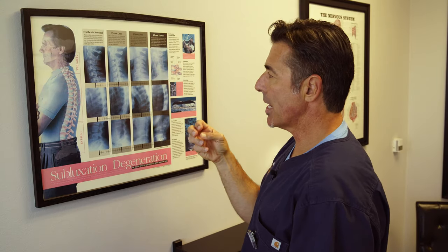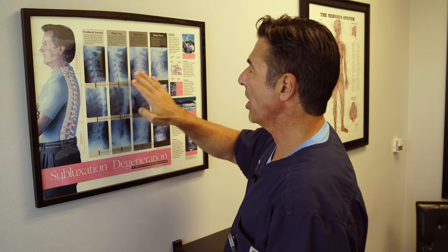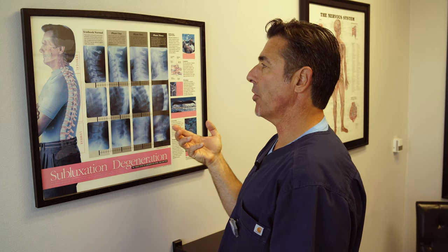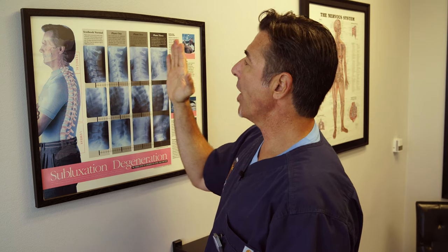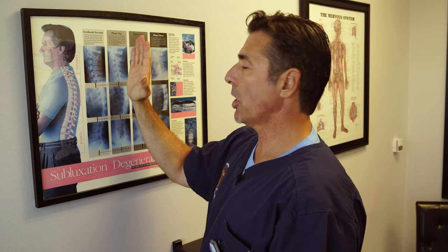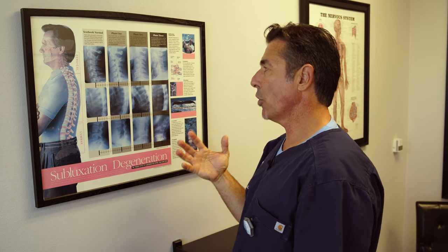The key takeaway is that any type of traction that forces the loss of your neck curve is going to ultimately cause this process of degeneration. Many of the home traction units out there — not Fisher Traction, but our competitors — are designed to either pull the spine straight or, worse, pull your head forward into the tech neck positioning, causing not only a loss of curve but actually a reversal of the curve in your neck.